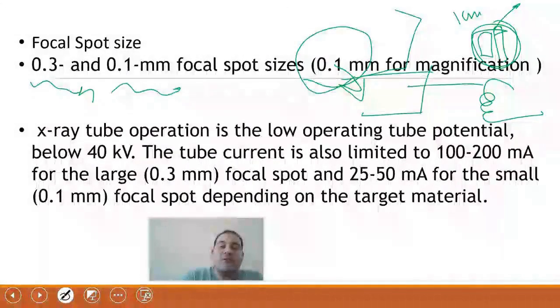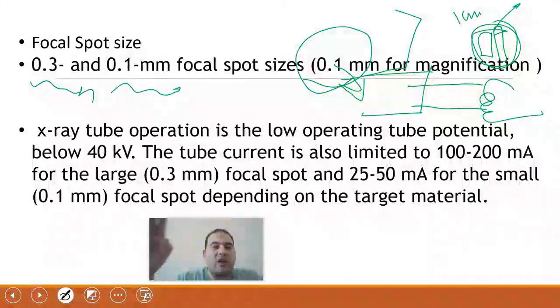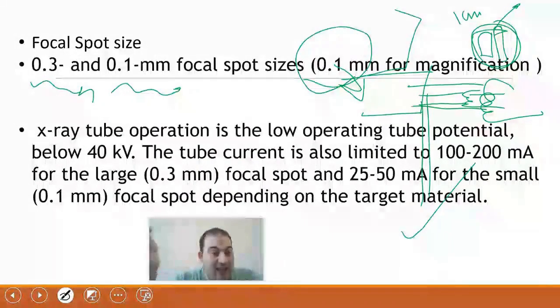Get a large actual focal spot size, which allows you to increase the parameters, and that's fine. In the case where I use the short filament, you reduce the focal spot size, which decreases the actual size, thus reducing the effective size, which increases the resolution. So you decrease the actual size, reduce the effective size, and increase the resolution. This means that with the same anode angle, you won't change anything, but you will change the filament size. The filament size will affect the effective focal spot size, increasing the resolution and adjusting the effective part of the magnification. Is that clear?